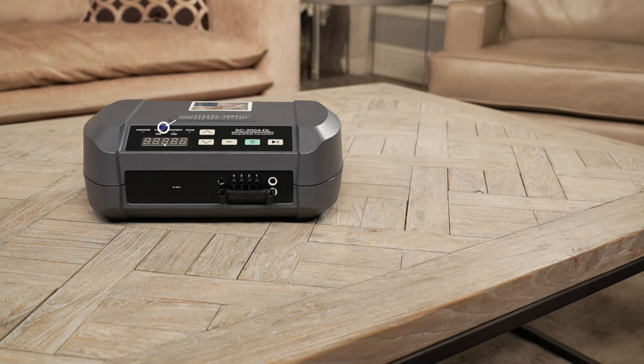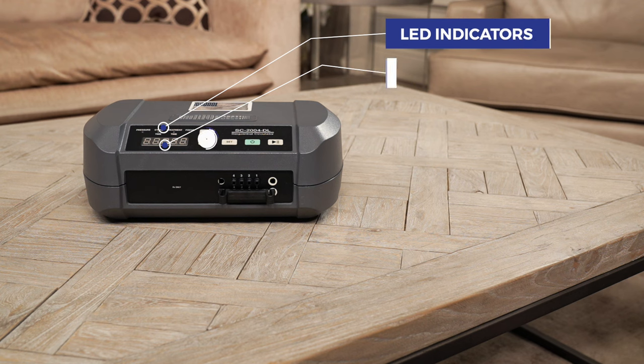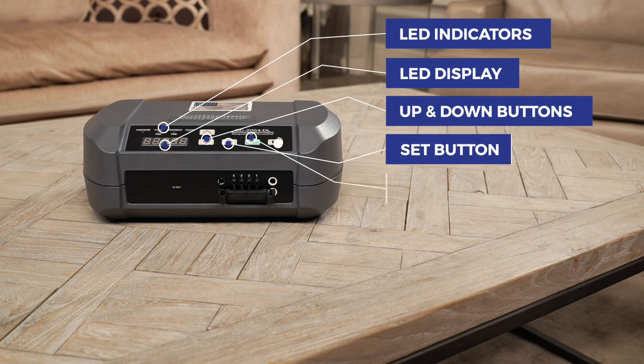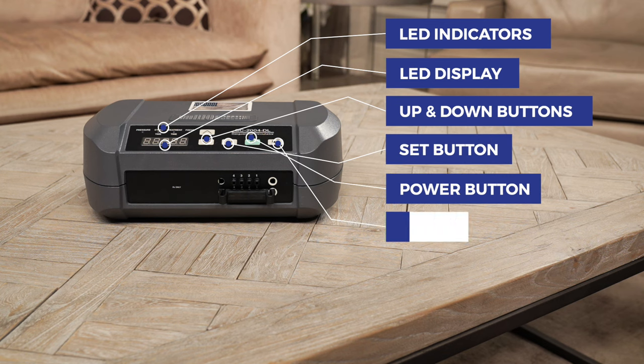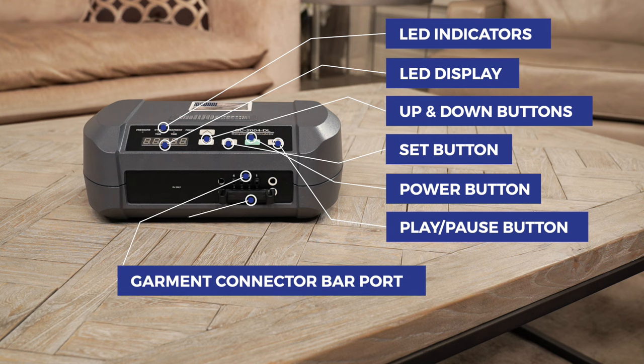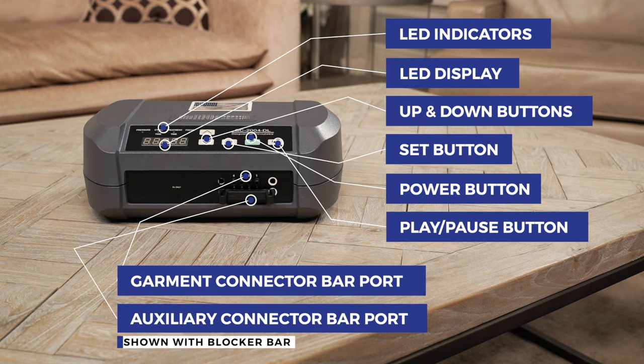These sequential circulators have LED indicators, LED display, up button, down button, set button, power button, play/pause button, garment connector bar port, and auxiliary connector bar port shown with blocker bar.